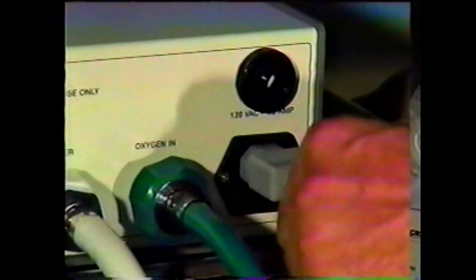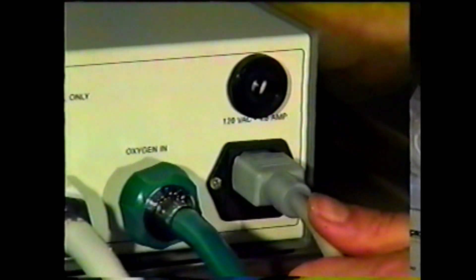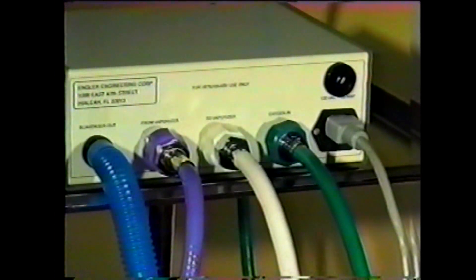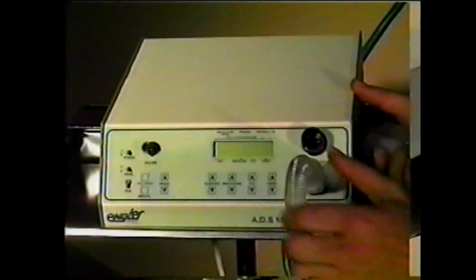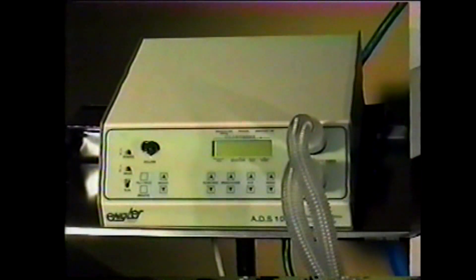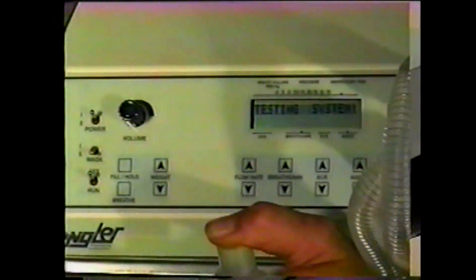Connect one end of the electrical cord into the ADS and plug the other end into an electrical outlet. When all of the connections are complete, the back of the ADS will look like this. Connect the breathing circuit to the breathing circuit ports at the front of the ADS. You may use your own breathing circuit if you wish. Cover the end of the breathing circuit with your thumb and push the power switch to the up position.